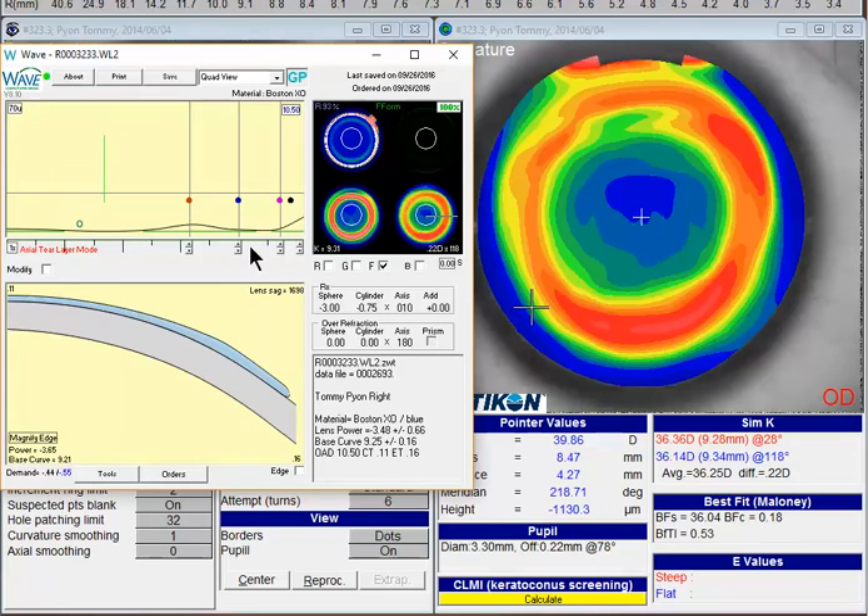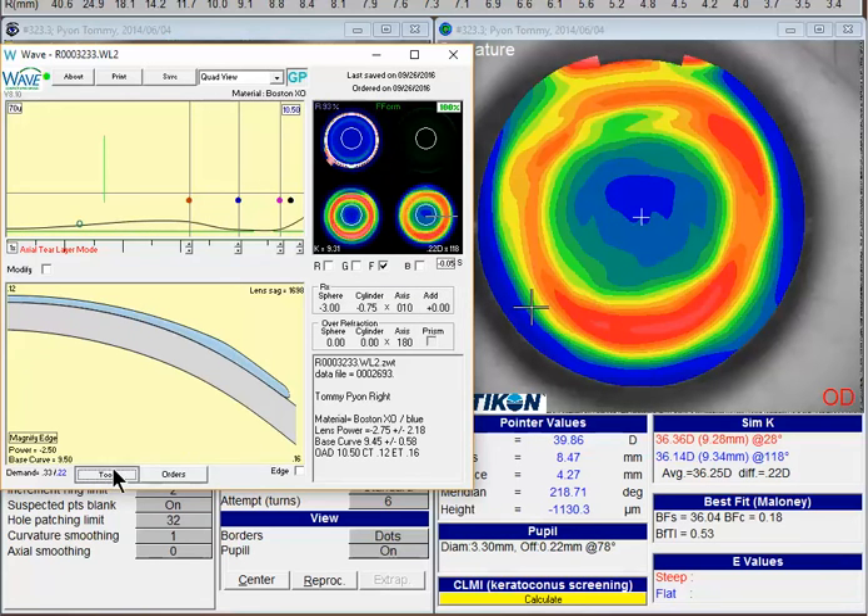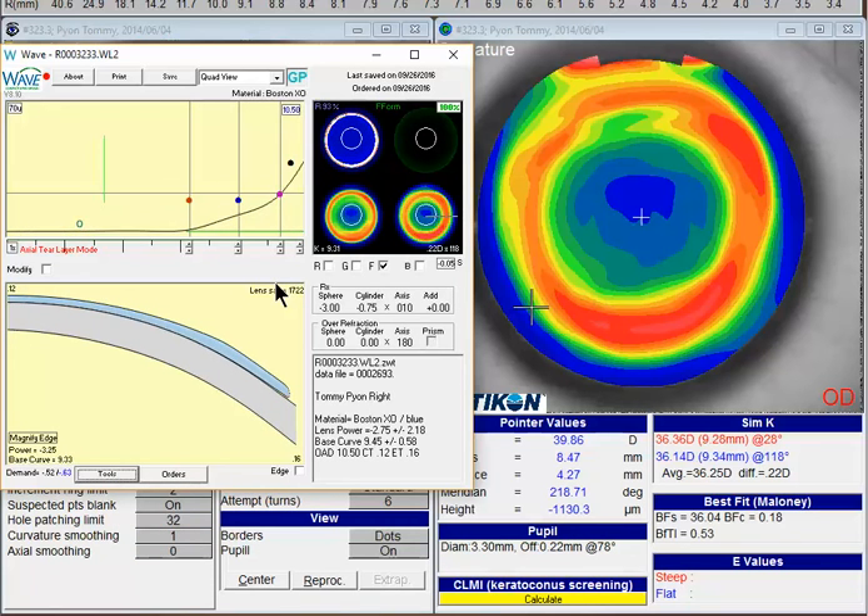The other option you have is to consider putting a little aspheric back surface on this lens by choosing the S factor — maybe look at about 0.05 or minus 0.05. Once again, letting the tools and current settings redesign this lens. We'll give it a moment to recalculate.